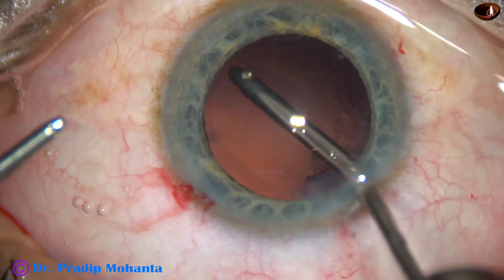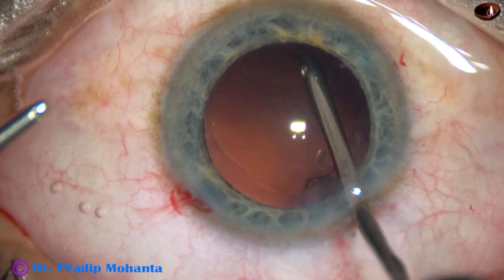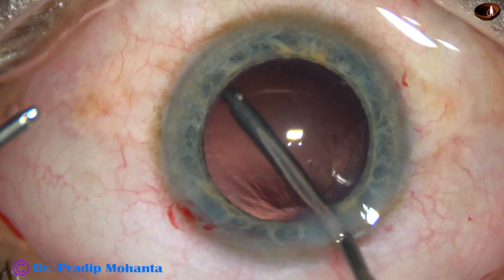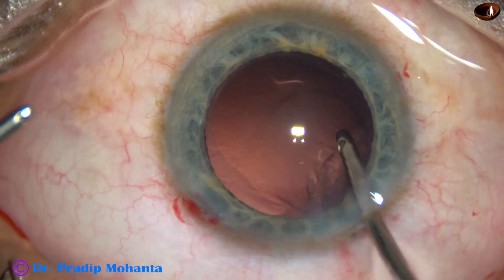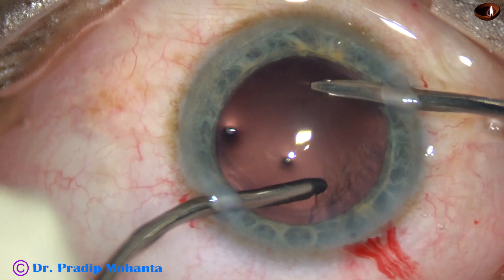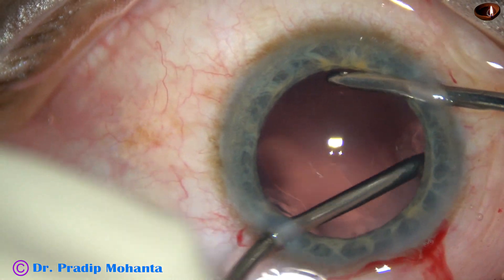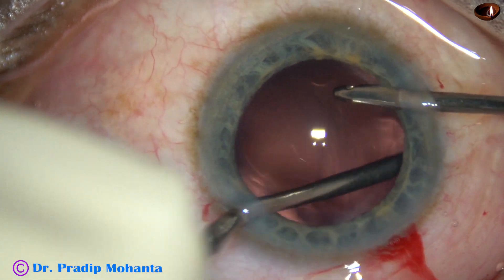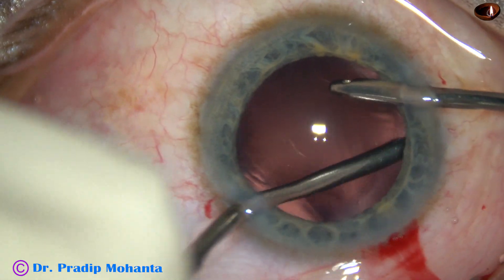Yes. Just by the fluid jet, it gets displaced and the posterior capsule is polished very nicely. We can call this hydropolish. And now, irrigation and aspiration together is being used to remove the sub-incisional cortex and the cortex from 10 o'clock. Yes, it is done. So, cortical clean-up has been very satisfactory in this case.